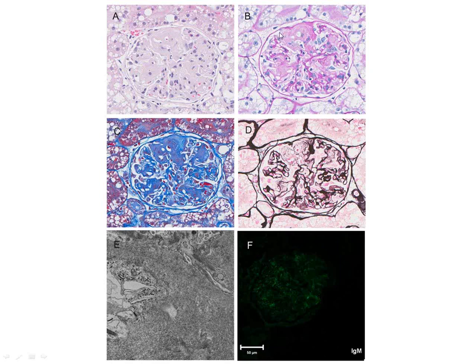It's going to have a weirder or stranger appearance. And on the trichrome, it's not going to look like normal glomerular basement membrane or normal mesangium. It's going to have this kind of atypical appearance. And so maybe having that word waxy in your head isn't such a bad thing, because it'll remind you that that could be amyloid in there.